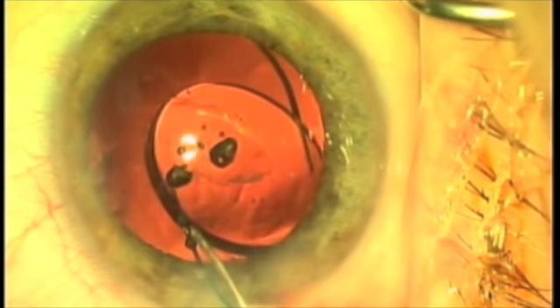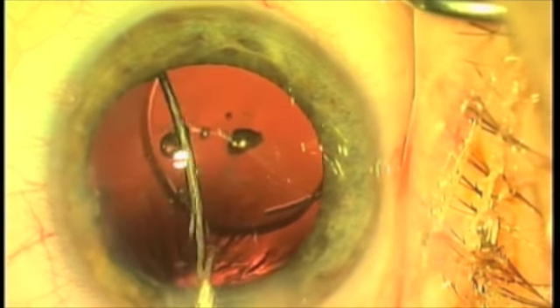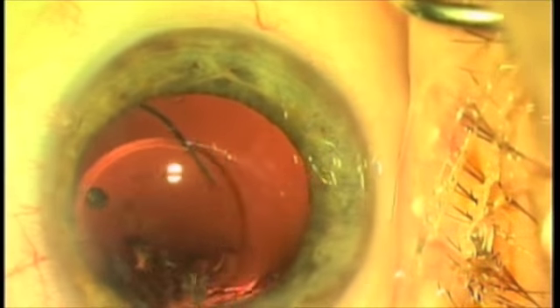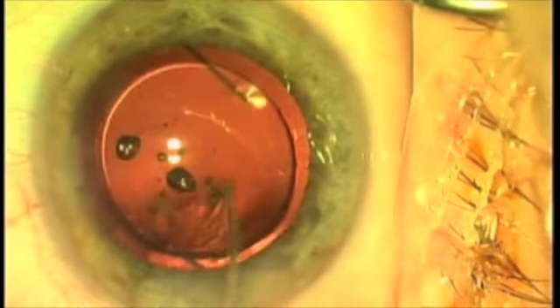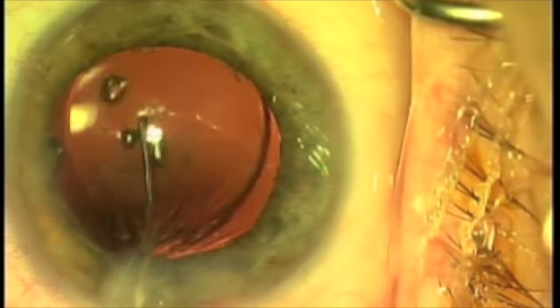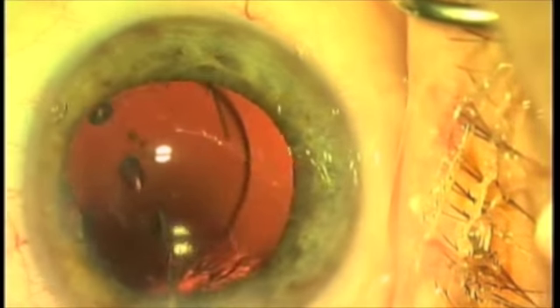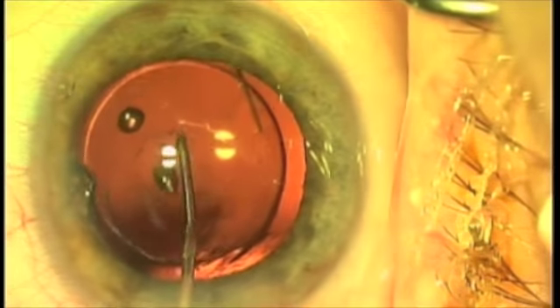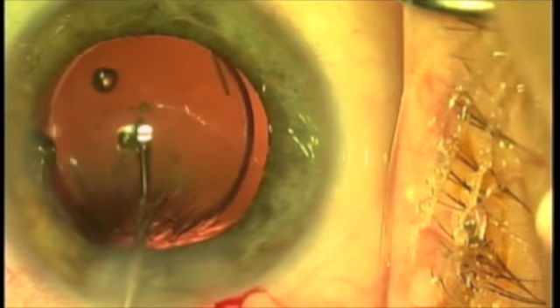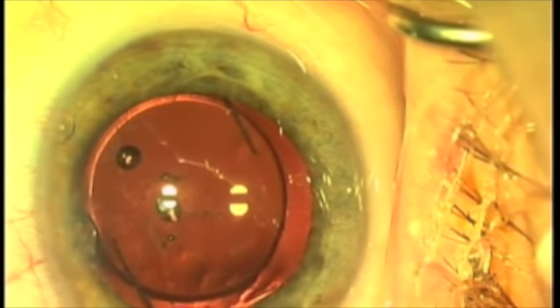We're going to just dial it into place. There is a very healthy capsule rim, and it's rare to see a subluxation of these IOLs. Watch the spring action of this IOL — because you've made a delightfully clean capsulotomy, and this has been documented by academic studies from major universities, you now have an equatorial section in which this IOL is securely fastened. The spring is the telltale sign of the beautiful fixation of this IOL.